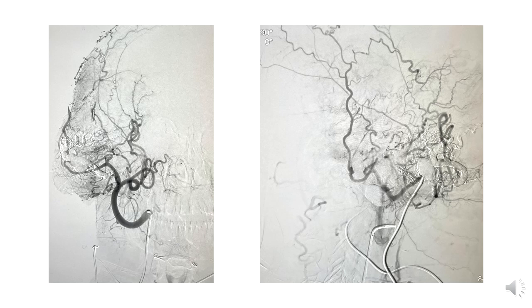An angiogram taken after this single puncture embolization. This particular injection was quite prolonged, which is also quite common once you have done a few embolizations, that you can keep on injecting glue, unlike when you are at the start of your career when the needle jams immediately.